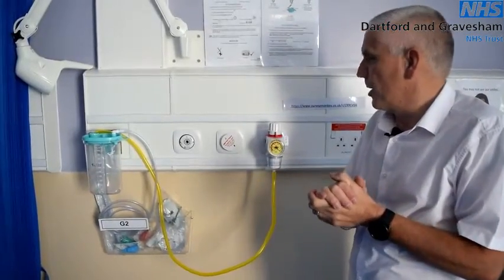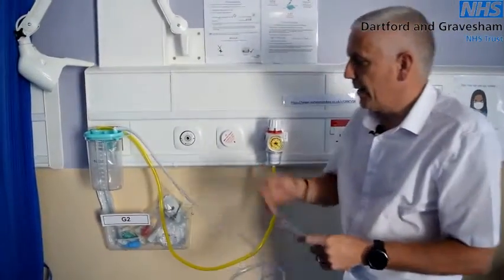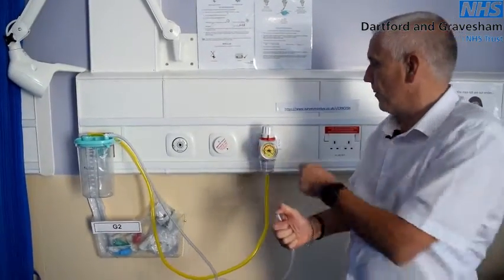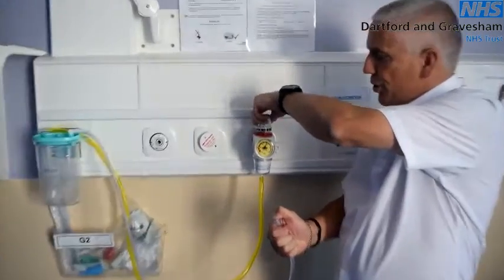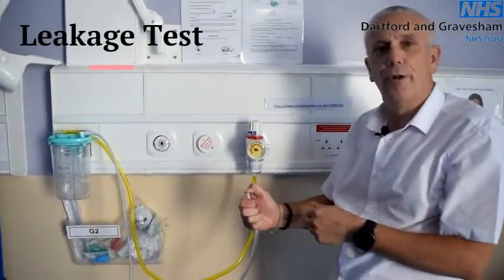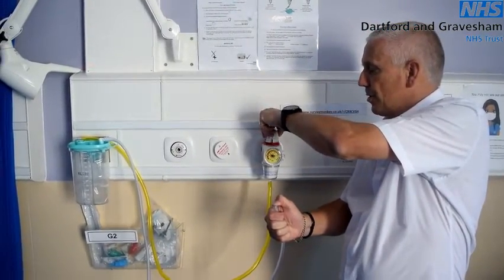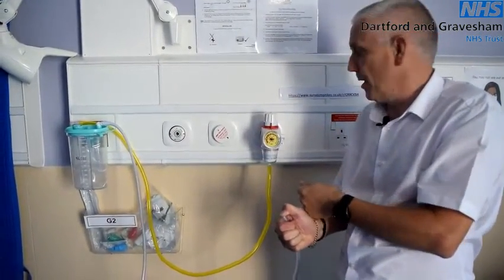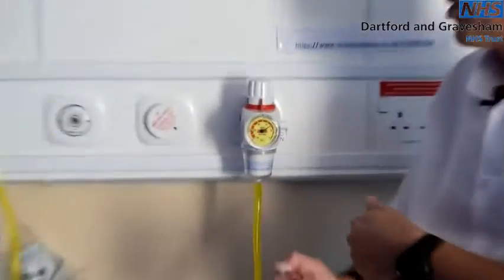To function check a suction unit: take your clear tubing, making sure the Yankauer is safely stored, and place your finger over the end of the tubing to cause a seal. Turn on the on/off tap, turn the dial, and the unit should reach a minimum pressure of 65 kPa. Keeping your finger on the end of the tubing, turn down the regulator to off — the needle should remain exactly where it is. This proves there are no leaks within the circuit. However, if the needle drops away, you have a leak in the system.